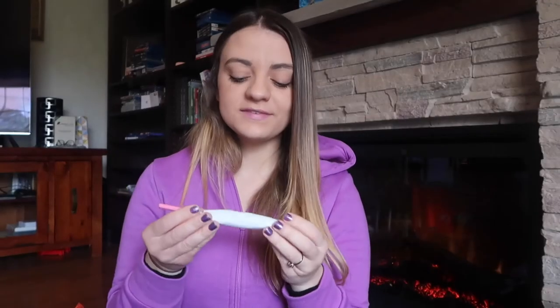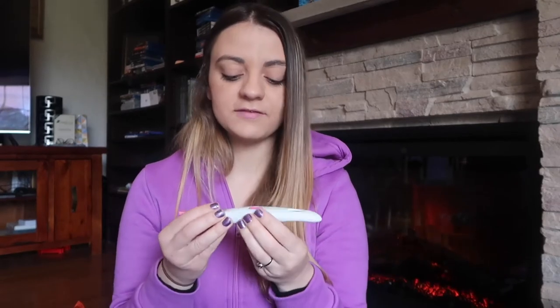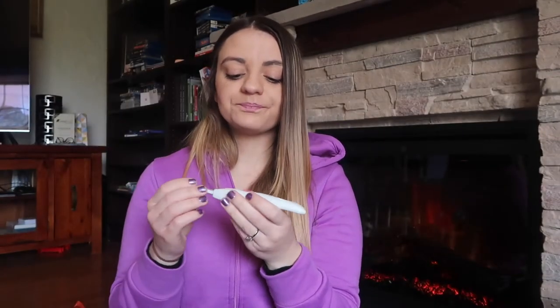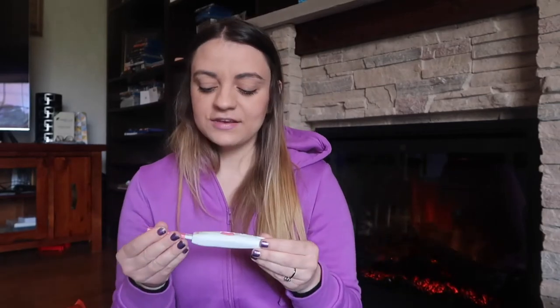Seeing that smiley face feels more definite — the test is definitely picking up that really strong LH surge, and it's a lot less confusing than comparing lines on a regular test. When you've finished testing, make sure you eject the test strip, because you don't want to confuse the test reader or affect the next test. Just eject properly and it will be good to go for the next day.